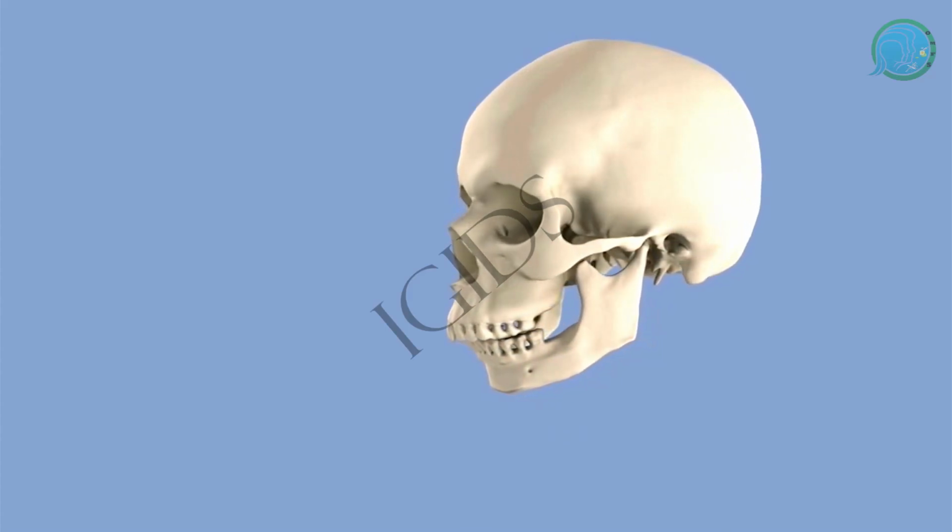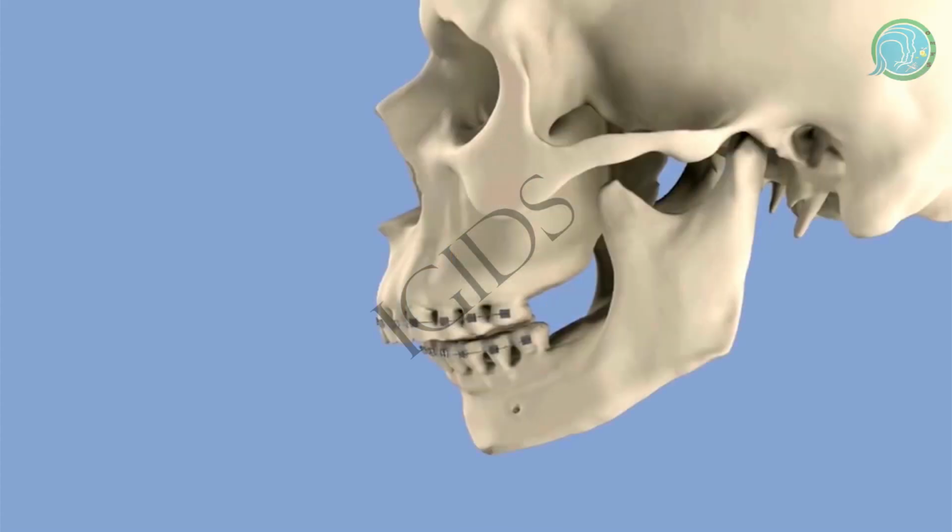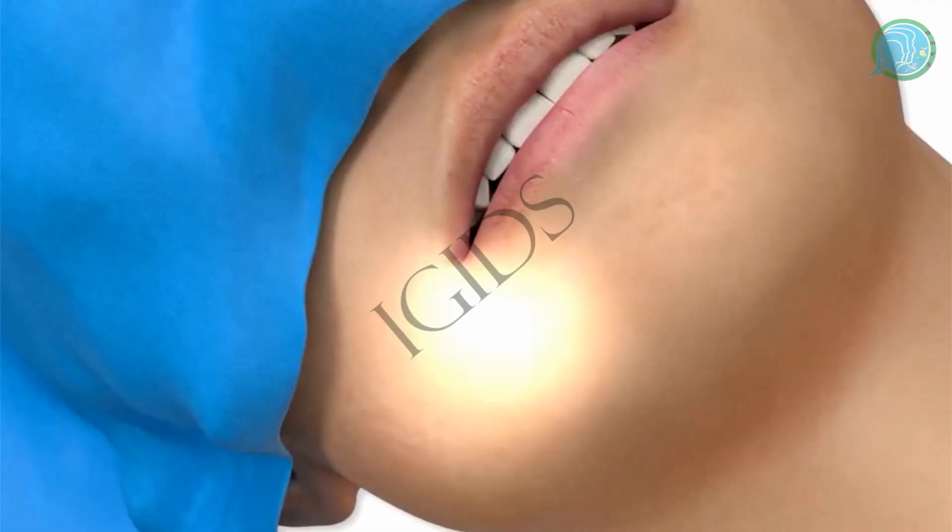Most commonly performed procedure for mandibular advancement and can also be utilized for mandibular setback. Let's see how the procedure is done.